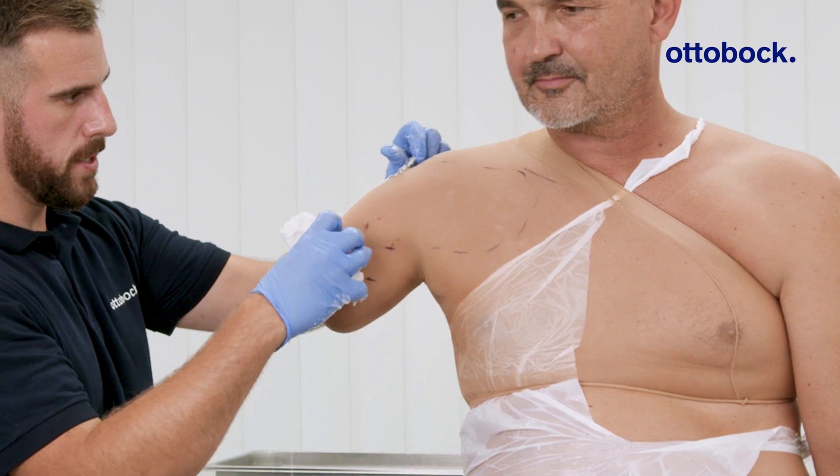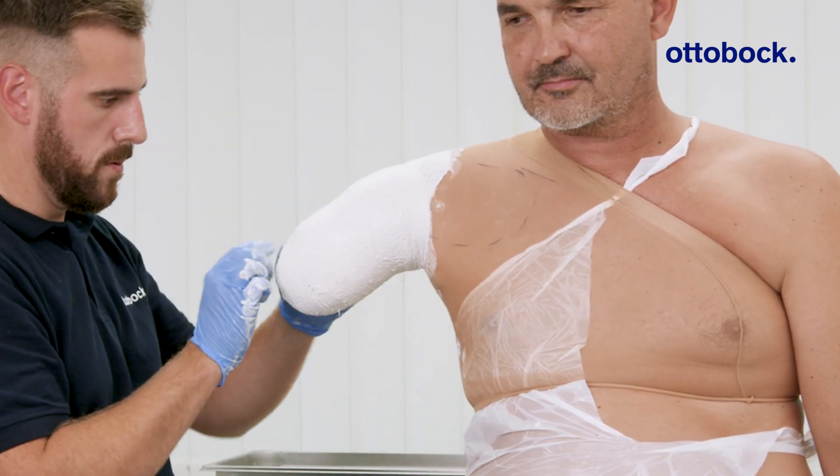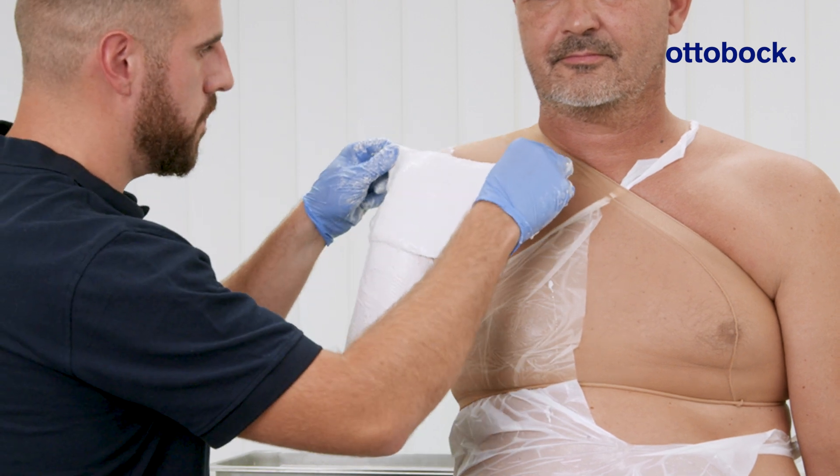This video demonstrates how to take a transhumeral plaster impression using a combination of elastic and non-elastic plaster bandages.